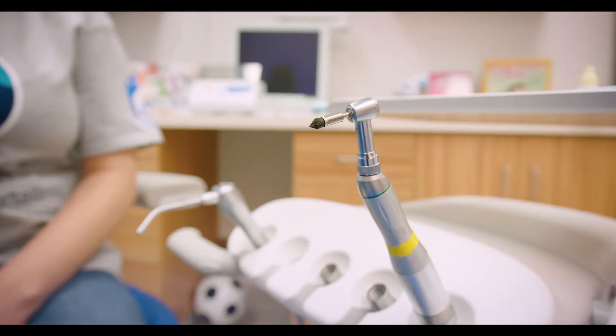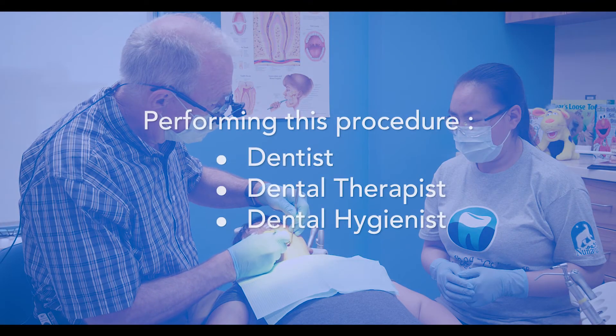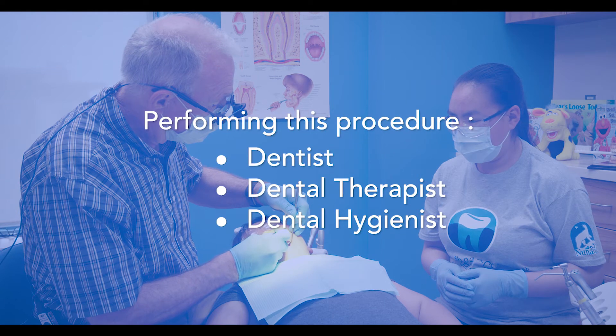There are no needles or freezing needed for this procedure. A dentist, dental therapist, or a dental hygienist can perform this procedure.